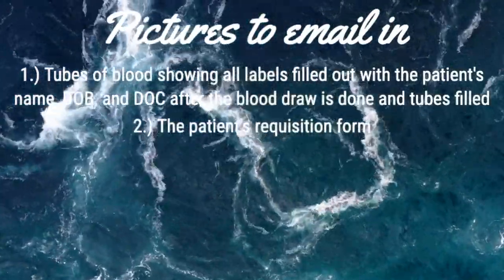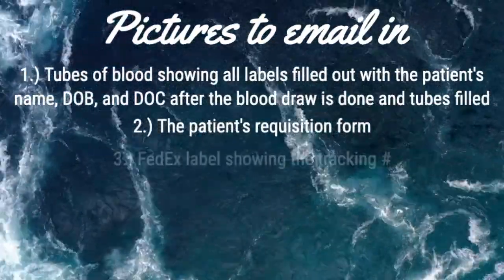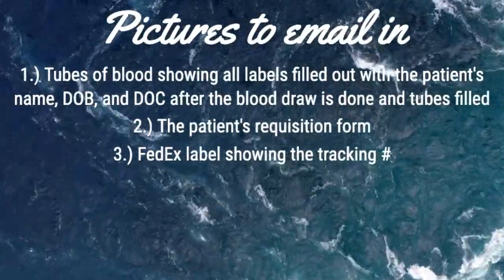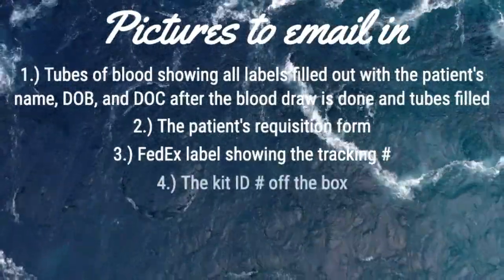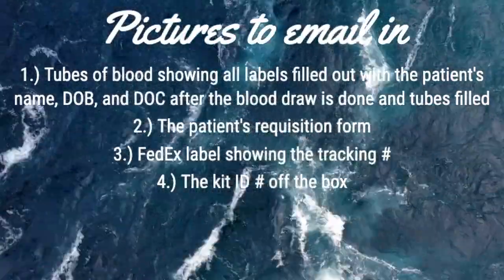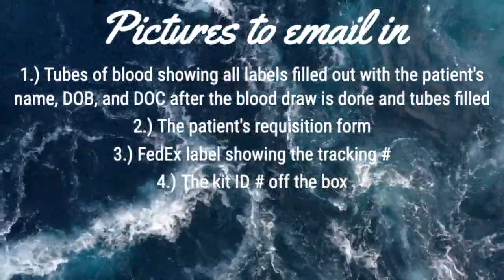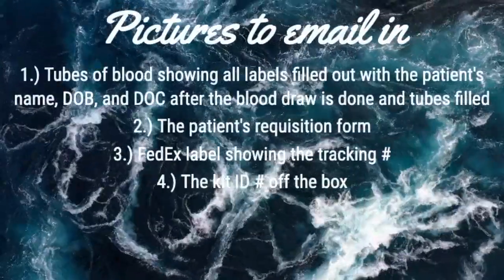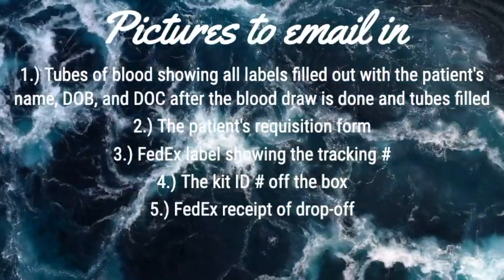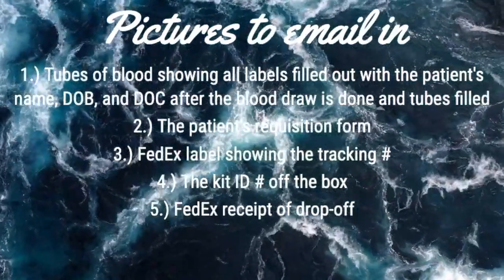2. The patient's requisition form with the patient's signature. 3. The FedEx label that shows the tracking number so we properly note it for tracking purposes. 4. The kit ID number off the box from the patient. The kit ID number is under a QR code, which is a sticker on the side of the box. 5. The FedEx receipt showing proof of drop-off and to what location.